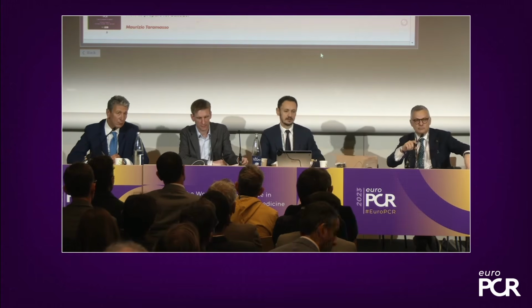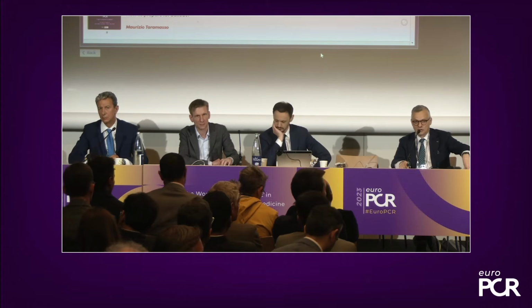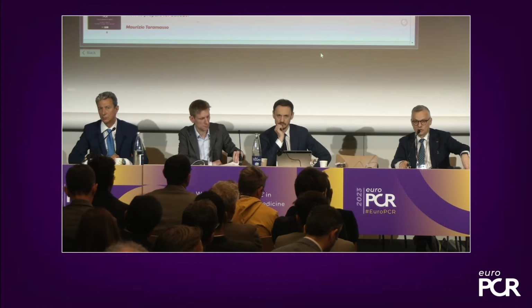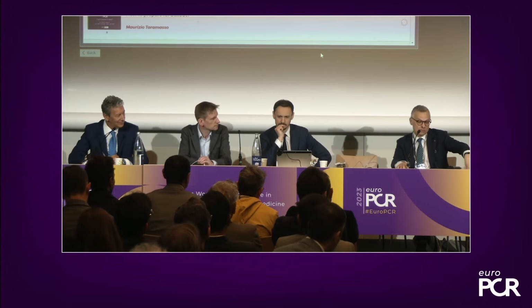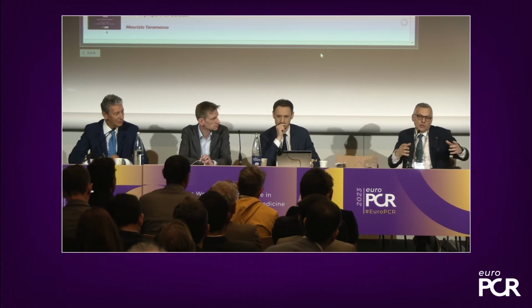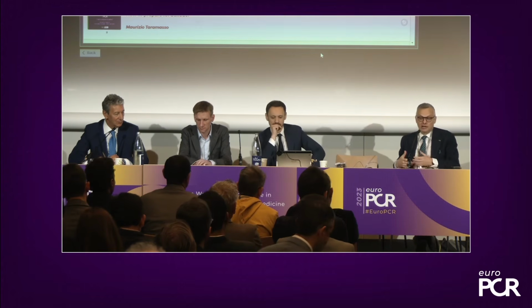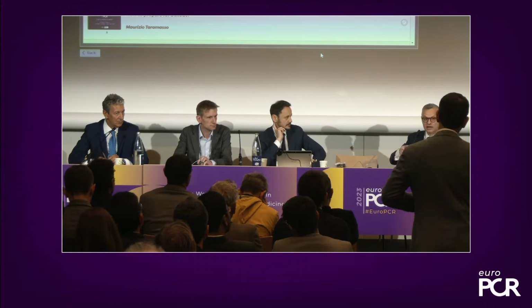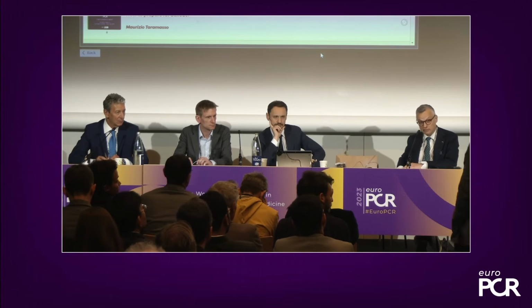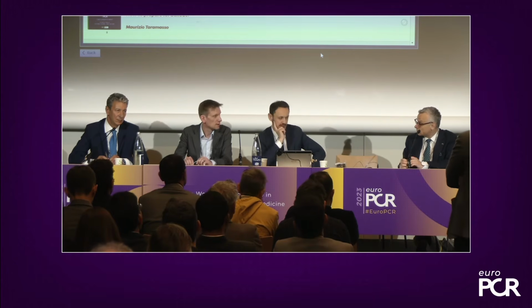First of all, I have a follow-up question. When do you perform control angiography? Before the wire removal or after the wire removal? That's a good question. Usually we do it after wire removal because usually what guides your decision is bleeding from the skin. Me personally, if there is no bleeding from outside, I pull the wire and that's it. But I don't know what you do, guys. What do you do? The same.